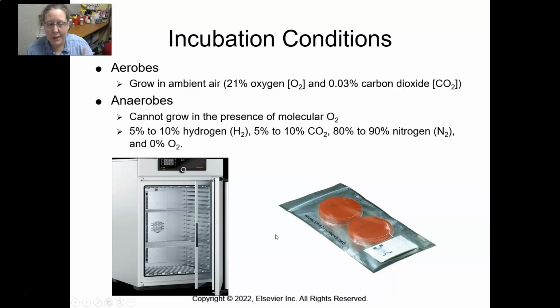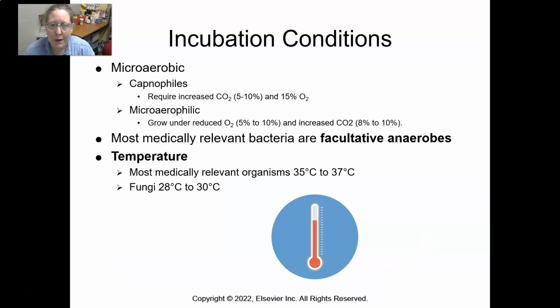Where I used to work, we didn't set up a ton of plates, so we used the zipper pouches, and it worked really well. For your microaerophilic, the capnophiles require increased CO2 and 15% O2, so it's a little bit less than the 21%, right? And the microaerophilic need reduced O2, so 5 to 10% O2, and increased CO2 at 8 to 10%. So those conditions, again, can be created in contained environments and then put into a regular incubator.